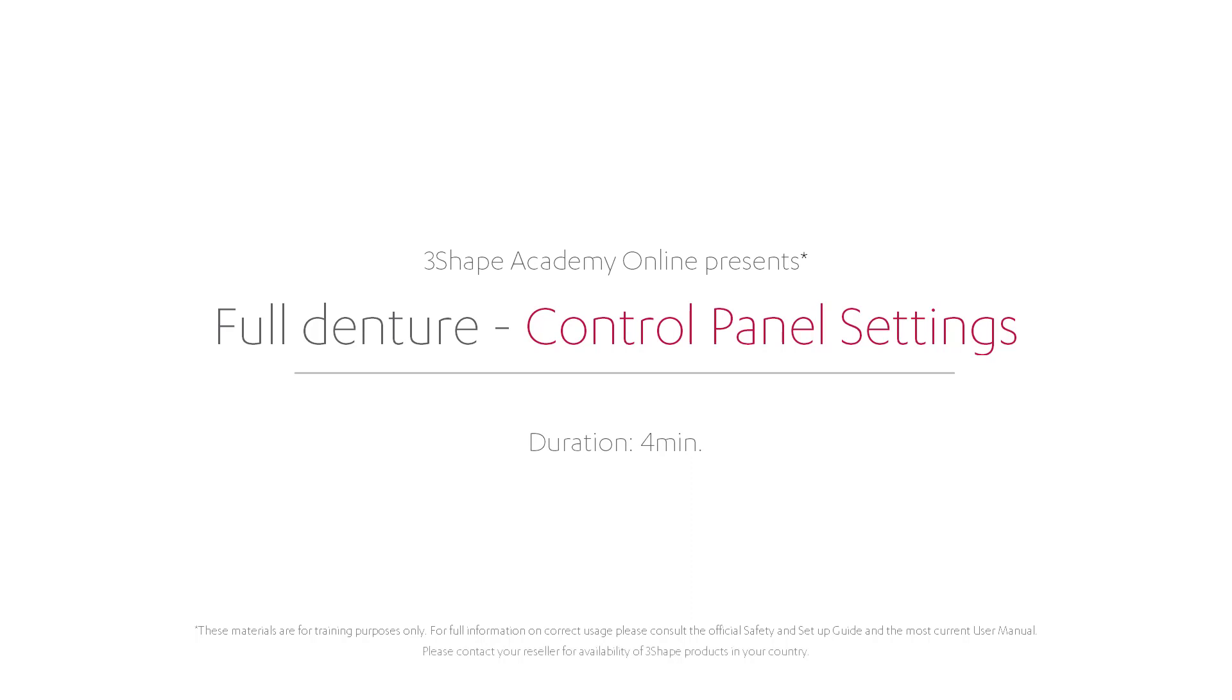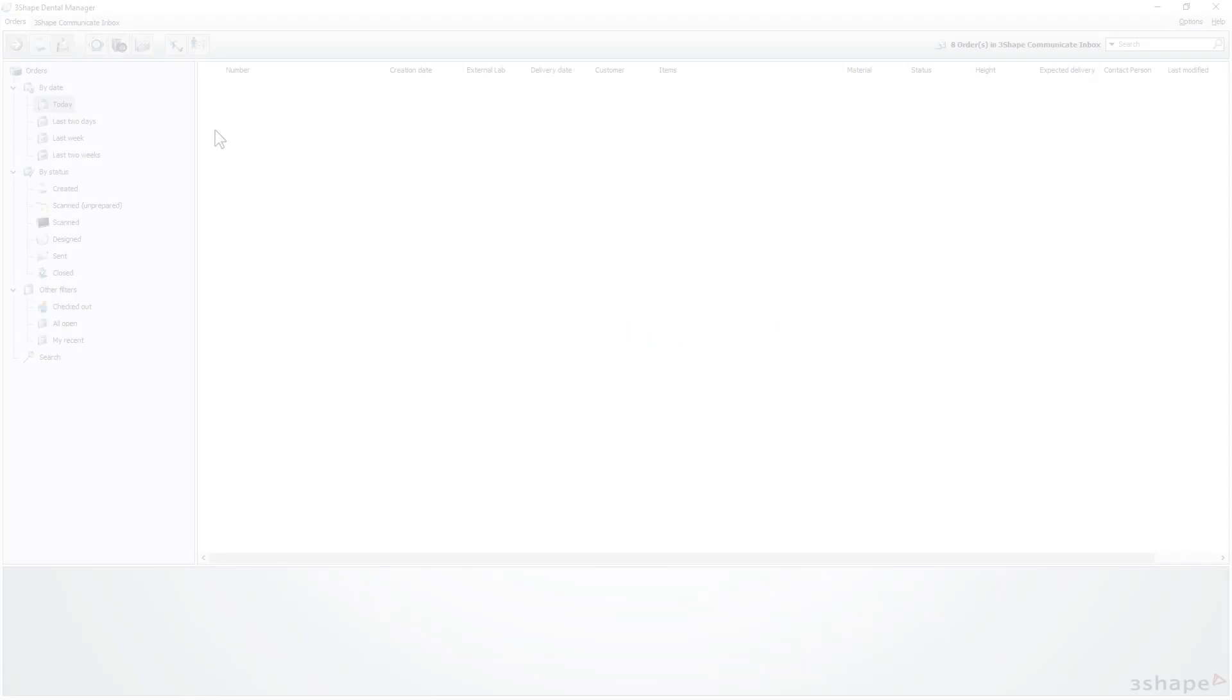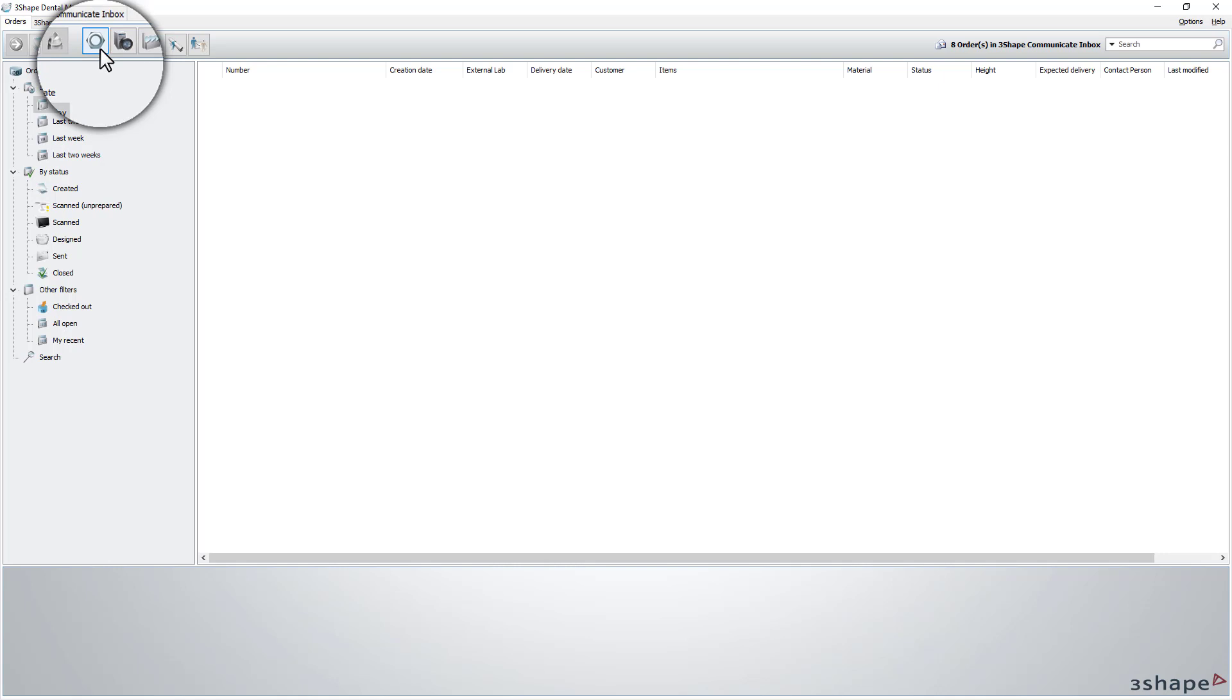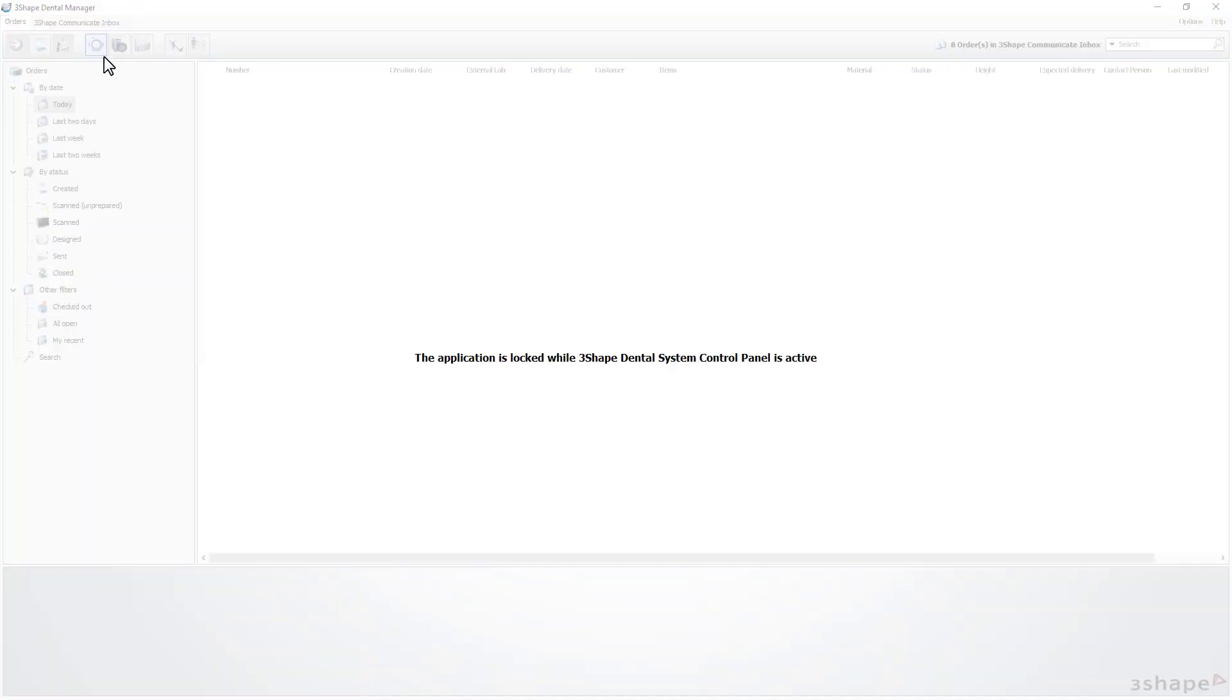In this video we will show you some useful options for full denture features which you can find in the dental system control panel. When in the dental manager, simply click on the control panel icon in the taskbar.